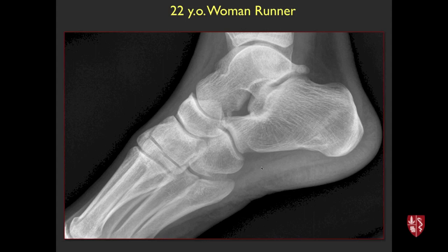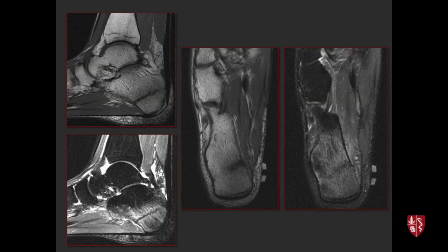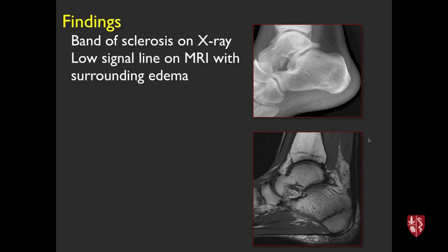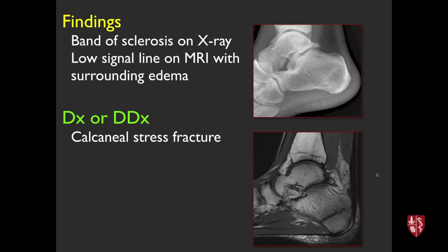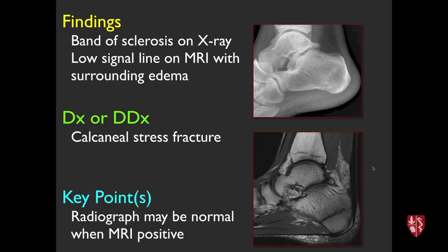22-year-old woman runner with heel pain. Radiographs show a band of sclerosis; MRI shows a low-signal line with a lot of surrounding edema on T2 — a calcaneal stress fracture. Key point: radiographs may still be normal when MRI is already abnormal. MRI is much more sensitive. When radiographs are positive, they tend to show this band of somewhat ill-defined sclerosis from little calluses along the trabeculae.